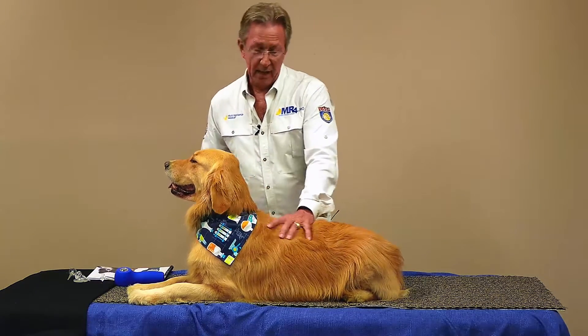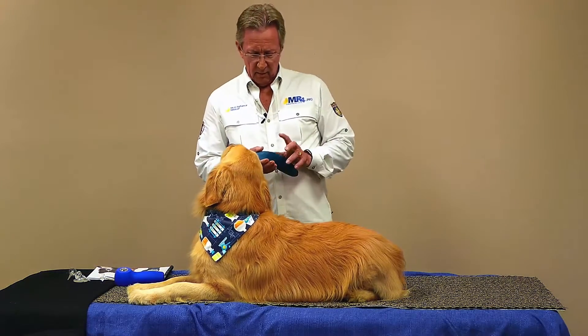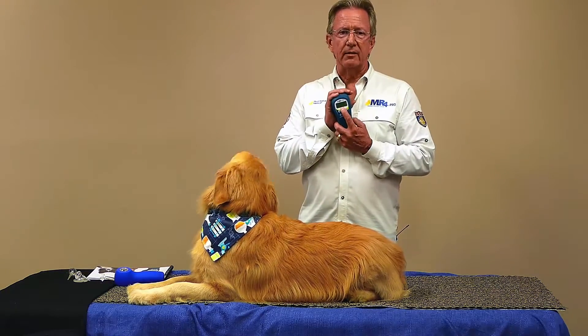First, do the unwind protocol at 1000 Hertz to provide pain relief. And then let's go to the affected joints — we want to use 50 Hertz for those to reduce the inflammation.